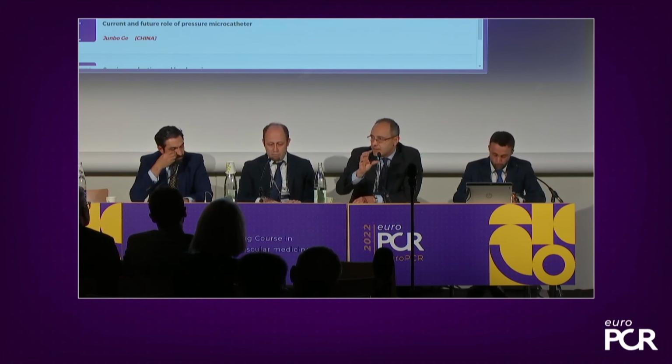It's totally right. Actually, this is something, as it was mentioned in the beginning, that we should take into account from the very beginning, before even embarking into a percutaneous coronary intervention. If we realize that there is a focal stenosis on a background of a diffuse disease, this can still be a case that we can take for PCI, because you can at least help a little bit by restoring the flow segmentally in these vessels.